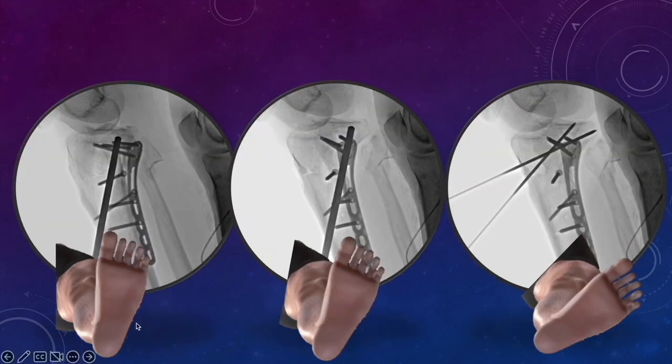Just rotate the tibia externally. So this is the kind of lateral view we get. But if we rotate the tibia externally, the lateral part of the proximal tibia will come posteriorly. So you see the fibula, which comes on the lateral part, has now been visualized in the posterior half of the view, and you will be able to see a good view of the posterior half of the lateral condyle as well. You see there is some residual depression here, which we were not sure of in this particular view. So we have to lift this depression to make it align with the periphery of the bone here.